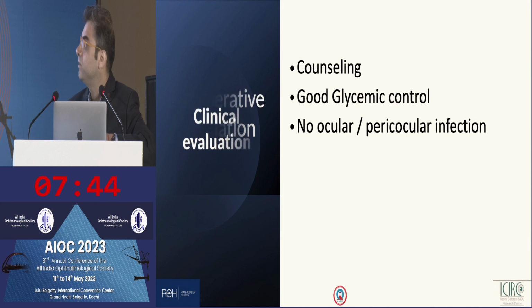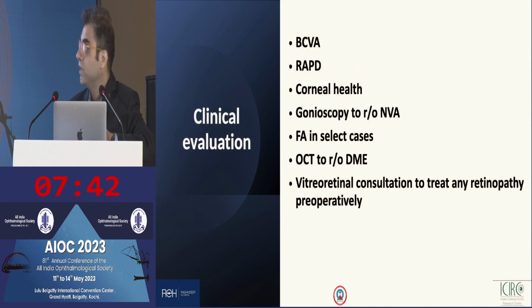I cannot emphasize more that these are the most important parts which have to be taken care of. And the most important in our institute is the OCT. We do OCT in almost all the patients, except mature cataracts and black cataracts where we cannot capture the images. So OCT is the first and foremost thing we should not forget in any of the eyes.